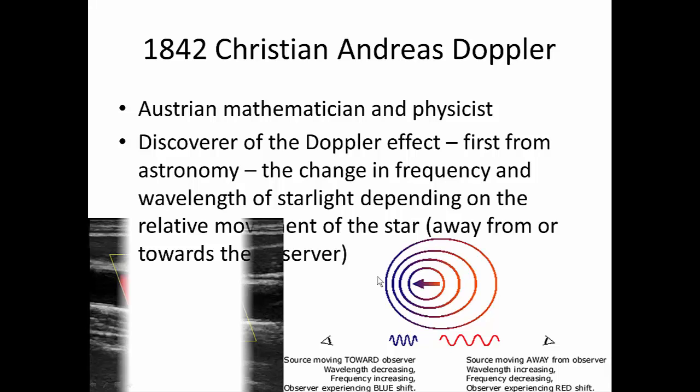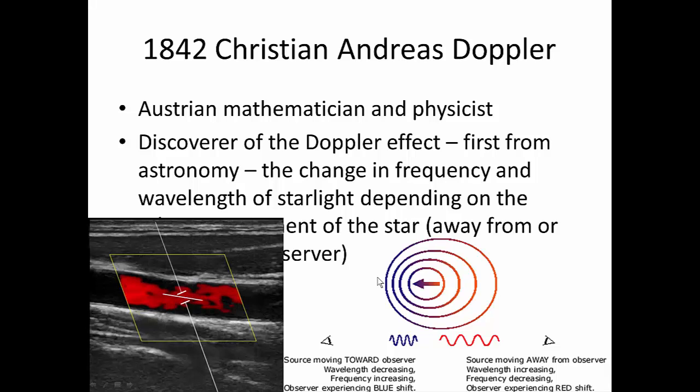In ultrasound, we can also make use of this effect by applying color Doppler, which will tell you if a fluid is moving relatively toward or away from the probe. Although the color that we apply to it is quite irrelevant, we can switch it on the push of a button.